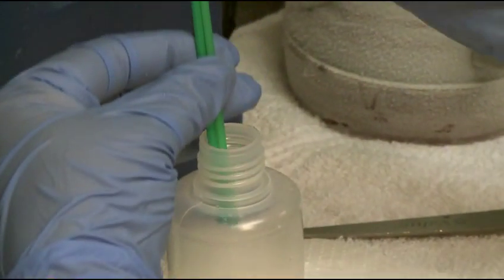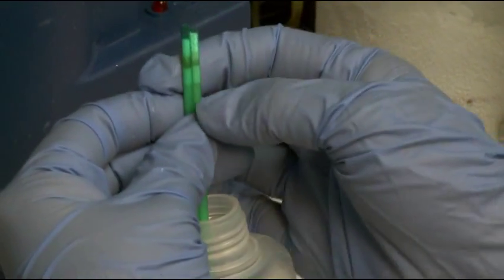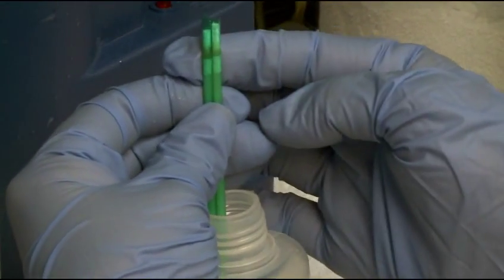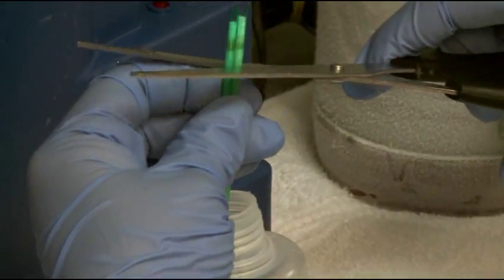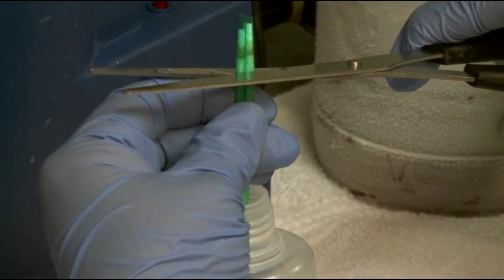Empty straws into the pre-warmed semen bottle at 26 degrees Celsius. Invert straws over the bottle and cut the cotton plug end to release the semen.